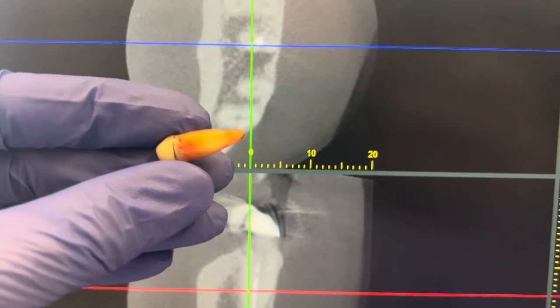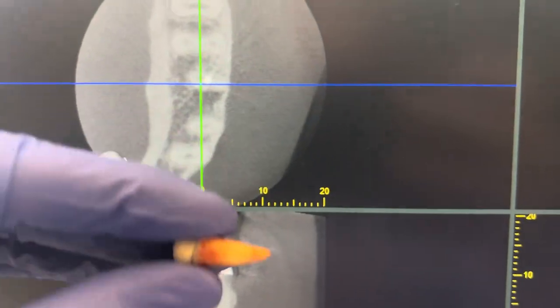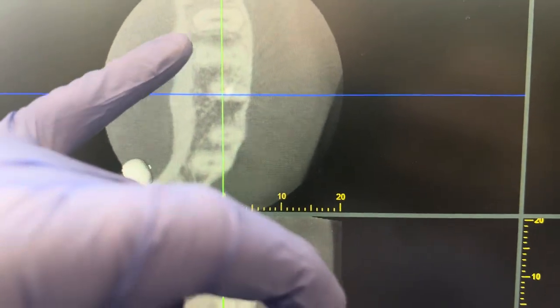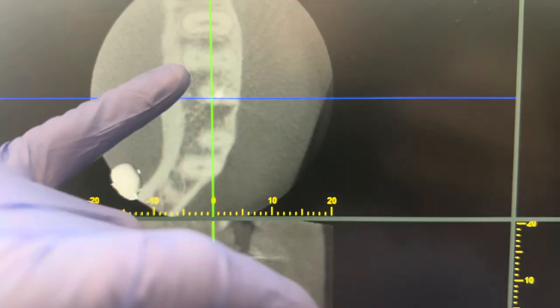All right, here's a short video on why you want to do a 3D x-ray before doing a root canal. If you look at this root here, it's got two canals. This one has one oblong canal.